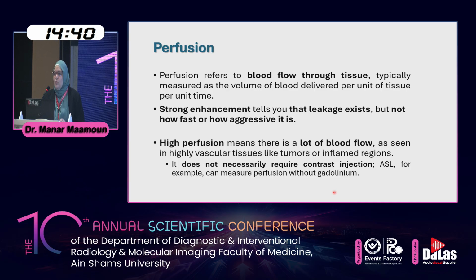Before starting, I want to make sure that you all get the idea of perfusion. Perfusion is not the same as contrast enhancement. Not every contrast-enhancing lesion is a hyperperfused one. Perfusion refers to the blood flow through tissues, while contrast enhancement refers to the leaky, abnormal vessels that leak contrast. Okay? So hyperperfusion means that there is a lot of blood flow within the tissue.